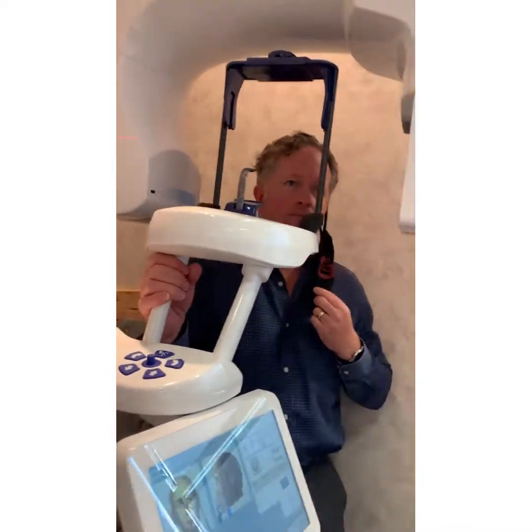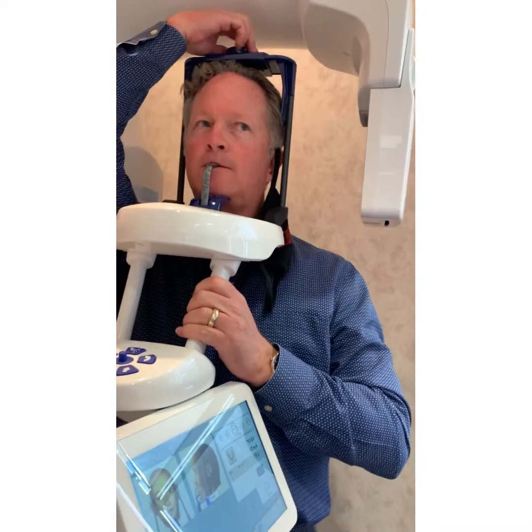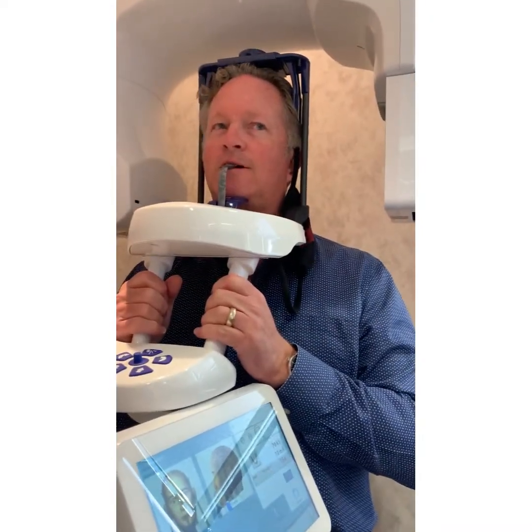Is there any adjustment made around their head? Because I know with the flappers you can pull them in. Got it. Yeah, that tightens it. Ta-da.